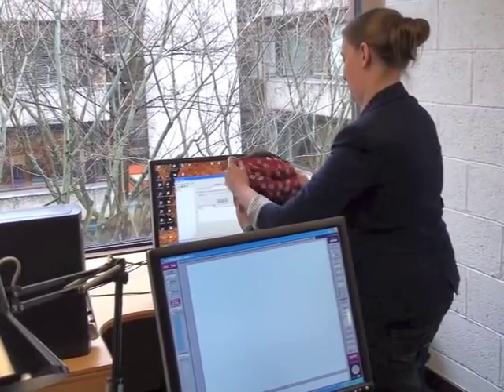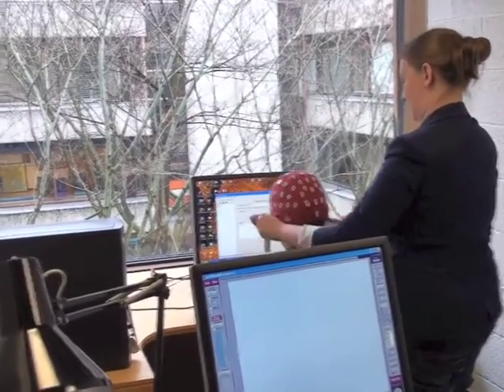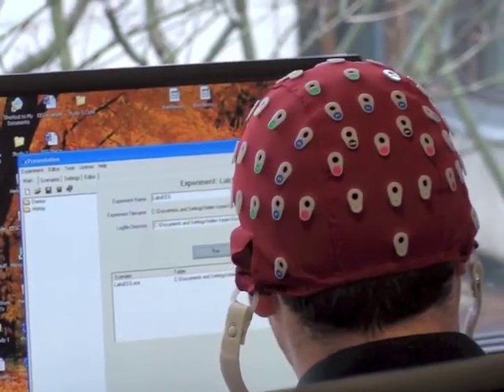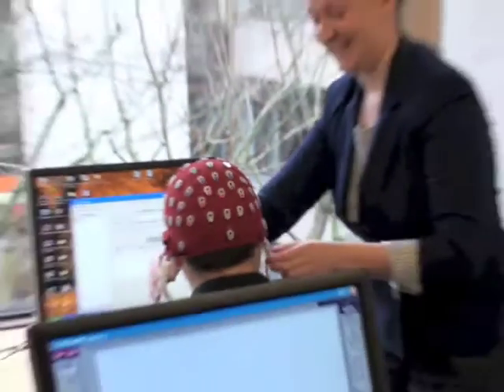Okay, sorry. Don't worry. You end up apologising to people a lot. I'll make sure your hands aren't freezing as well, because it's not nice. But it's kind of like hairdressing. You get to talk to people really well when you're doing this.